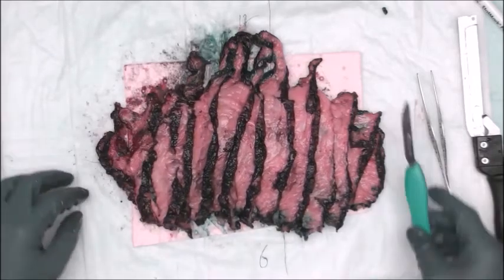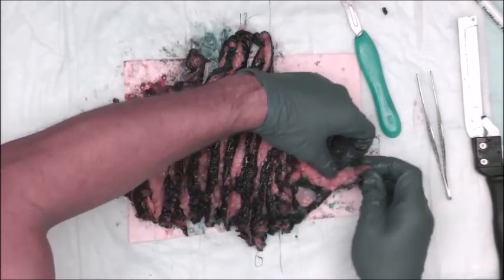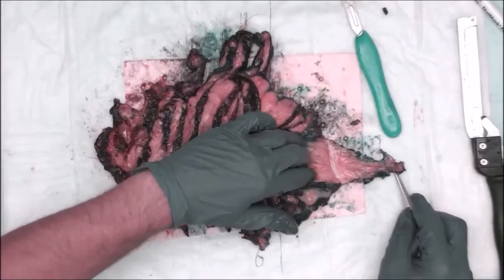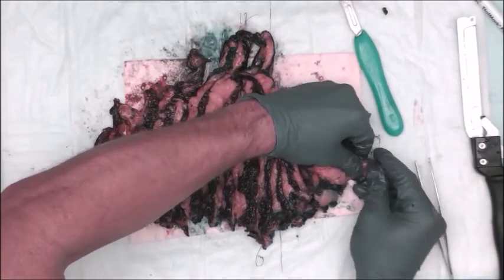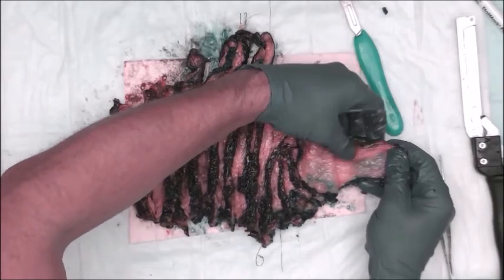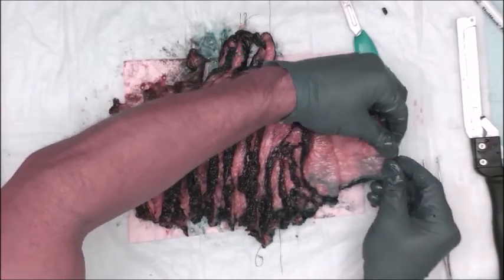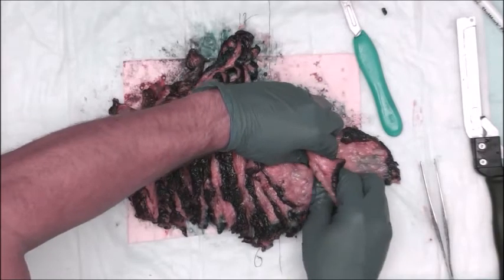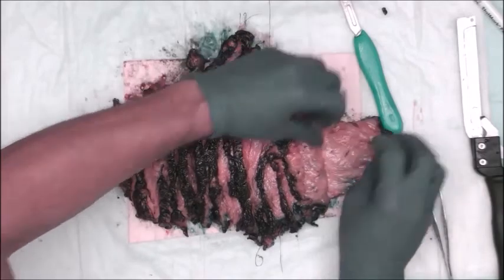All right, so then what we do is we begin at one end of the specimen, and actually what I do is I put out the slice like this, initially look at it, and see if I see anything. And if I don't, then I'll begin palpating it. Same thing with these additional slices here. And I make sure I go all the way down, make sure I get all the periphery, the deep margin, make sure I don't miss anything. And just continue on through the slices, just like that.